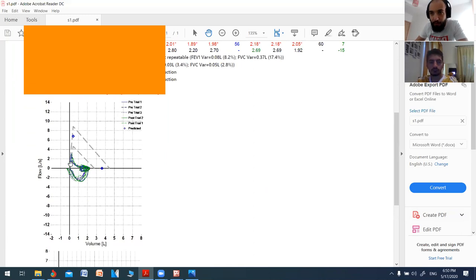What do you see in the loop? Does it reach the vital capacity? No. Does it look normal in the flow of expiration? No, it has decreased flows, right? It has that concavity here with very decreased flows at 50 and 75, right? So what do you think of this? Obstruction, restriction, or mixed? Mixed. Volume modification and expiratory flow modification. I think that it is mixed.